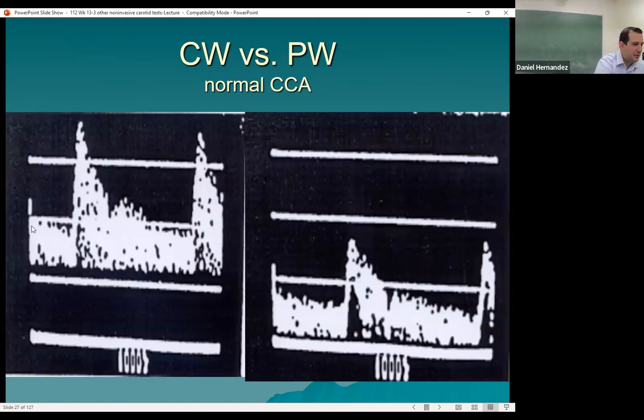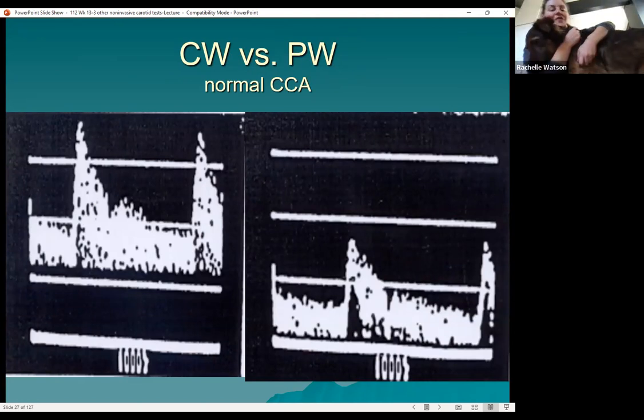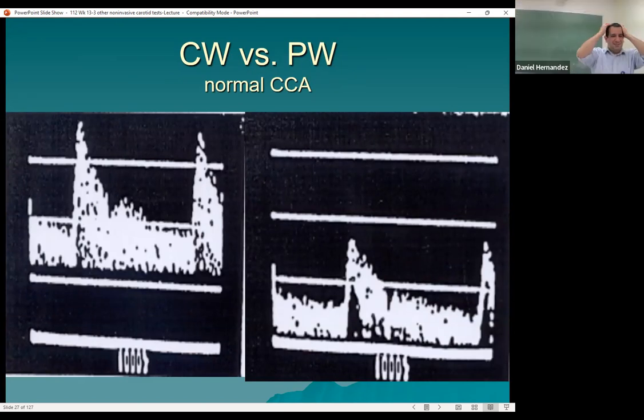So you guys in echo now, when you image, have you done continuous wave or played with continuous wave and pulse wave a little bit? Oh, hello, puppy. Yeah, a little bit, or no? Did you try like LVOT?